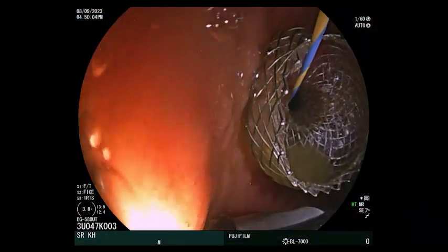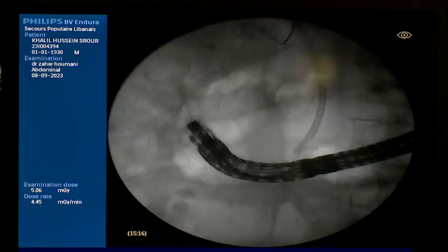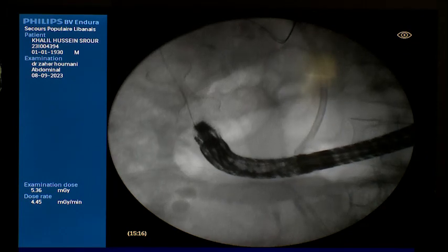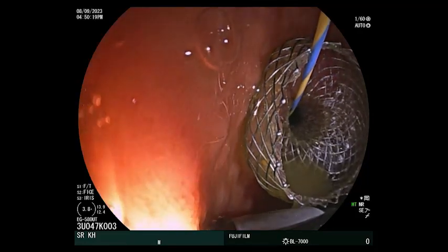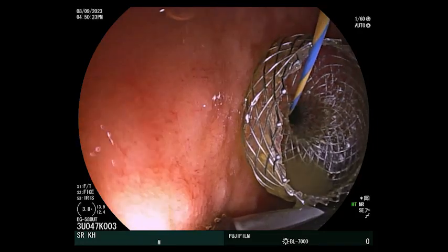So normally the diameter for draining the gallbladder is ranging between 10 to 15 mm, depending on the wall of the gallbladder. In this case, it was nearly a normal gallbladder wall because it was not a cholecystitis. So this is the endoscopic part, okay?